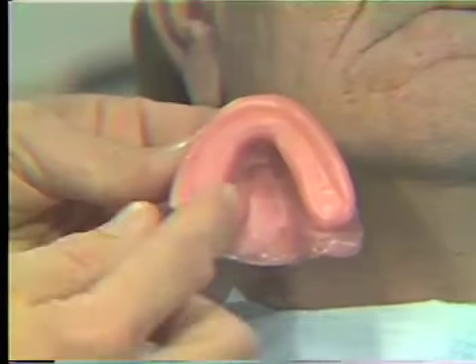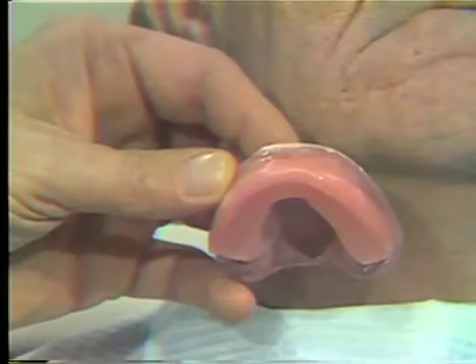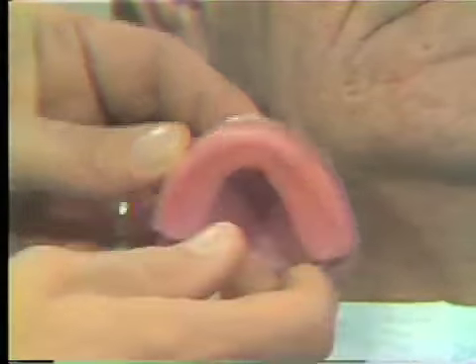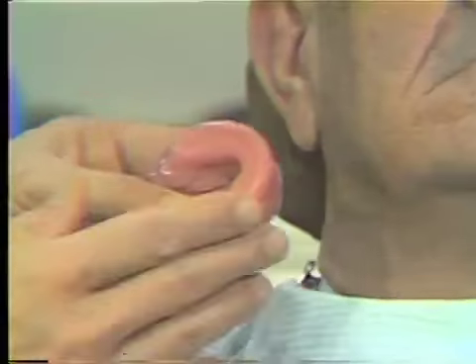As you can see, it has squeezed out both lingually and buccally, and then we will contour the maxillary rim to give us some idea as to where we're going to set the maxillary teeth for proper lip contour. If I place this back in Mr. Monahan, now you can see that his lip is a little bit too full. It is pushed out by the wax rim, so we'll trim some of this off. Okay, open. And again, we'll go back to our Bunsen burner with our putty knife and remove the excess.